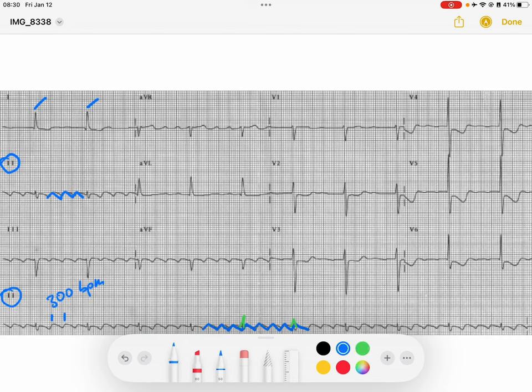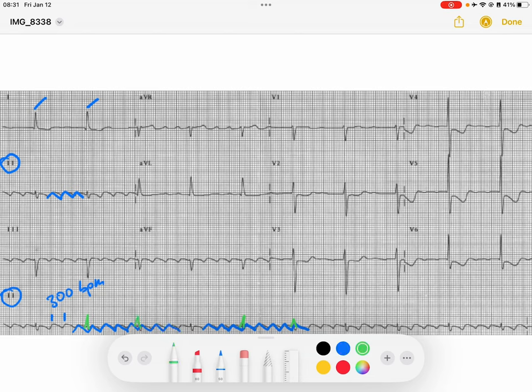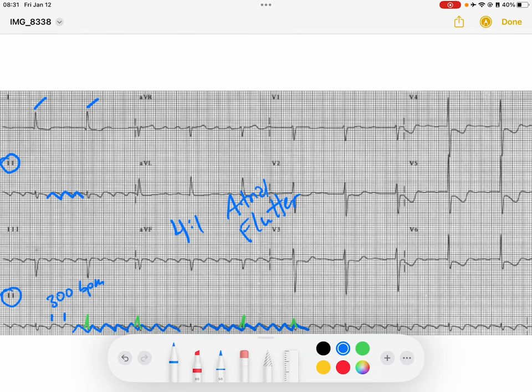Whatever you count your flutter waves, wherever you start your flutter wave count is where you need to end it for each QRS. So if the flutter wave before a QRS is number one, then two, three, four — that's your complex of four flutters per one QRS, then start over. Be aware of flutter waves that are buried in the QRS complexes. In four-to-one atrial flutter, the flutter ratio change means our ventricular rate gets slower.